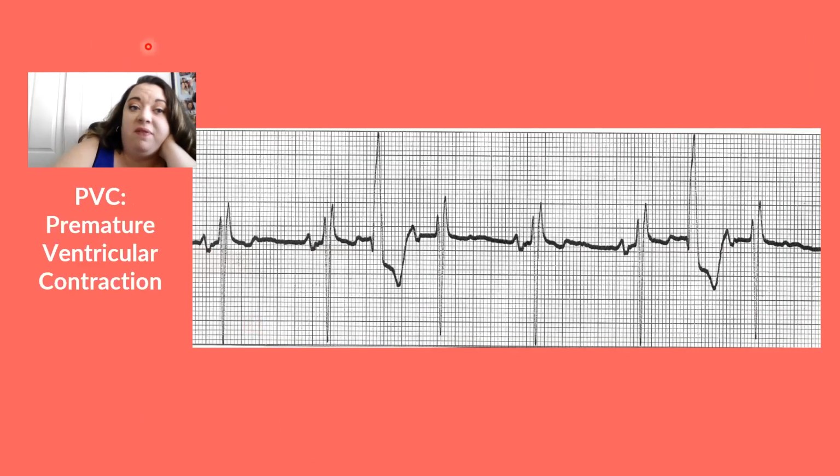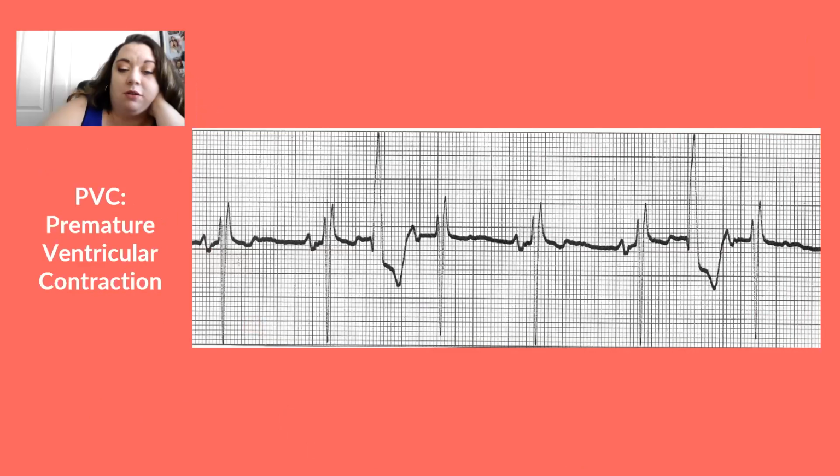All right. PVCs are really hard to miss. Again, you're going to have a relatively normal rhythm under it. So if I spaced all these out, these are happy, right? But then my next beat should have showed up here, and instead it showed up here. So this beat is early. And really, guys, with PVCs, because they're generated from the ventricles, they are very, very wide, complex beats. So the beat showed up early and it's super wide, complex. That's how you identify that as a PVC as opposed to PAC or PJC.